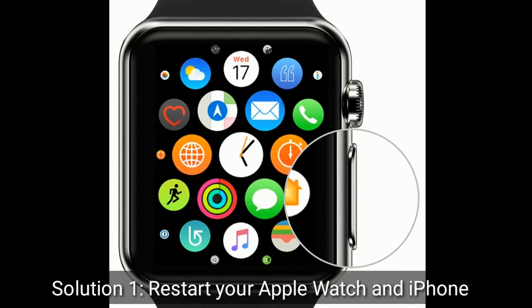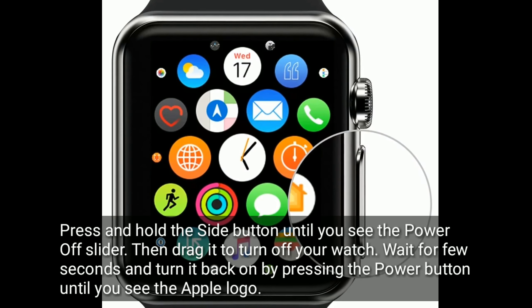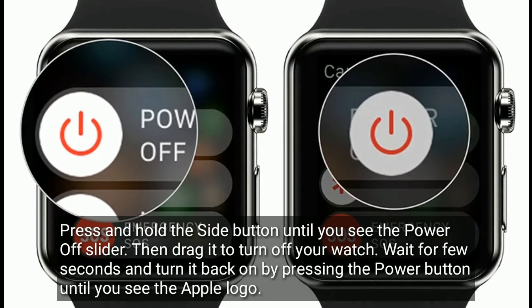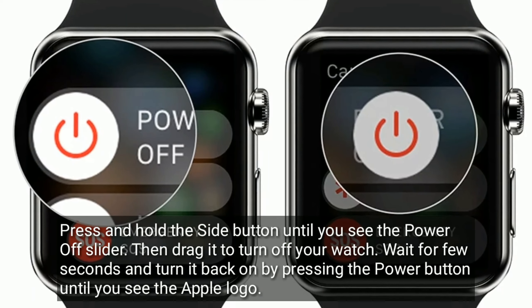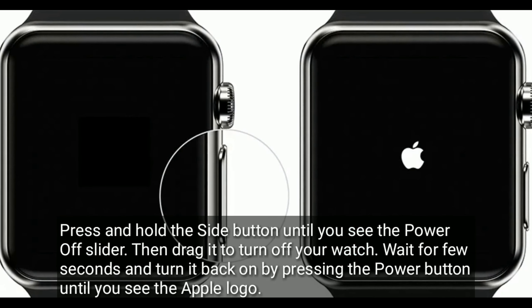Solution one is restart your Apple Watch and iPhone. Press and hold the side button until you see the power off slider, then drag it to turn off your watch. Wait for a few seconds and turn it back on by pressing the power button until you see the Apple logo.